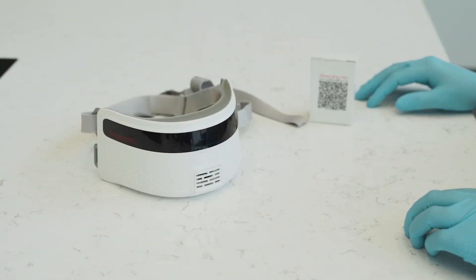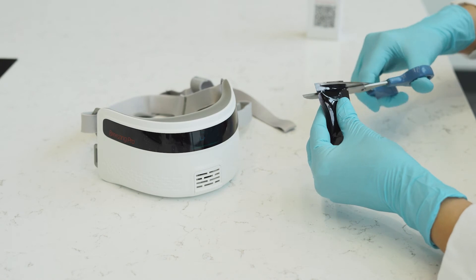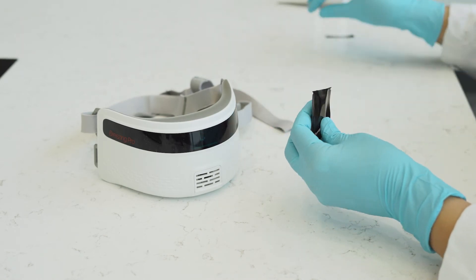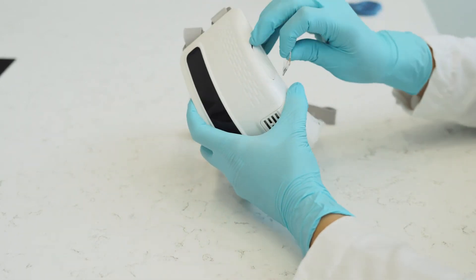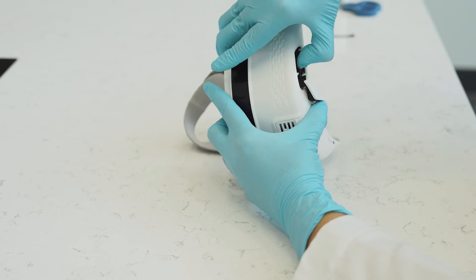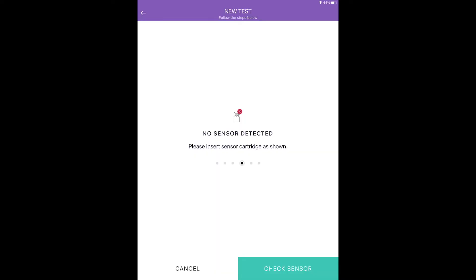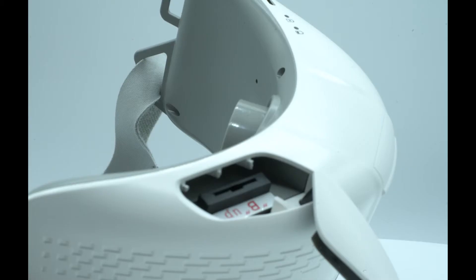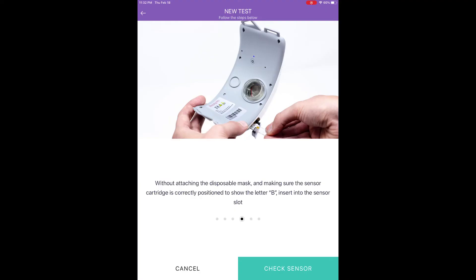Step six: Insert Sensor. Open a new sensor pack and remove the sensor; the pack can be opened with scissors. Take the sensor with the letter B in the right position and insert it into the sensing chamber on the bottom of the device, embossed with the letter B facing the front of the device. Close the sensor chamber cover, making sure there is full closure. It is important that once the sensor pack is opened, you insert the sensor into the device and close the sensor chamber as quickly as possible. The sensor is one-time use and each test requires a new sensor. Do not attach the silicone mask yet; the app will instruct you to do so in a subsequent step.